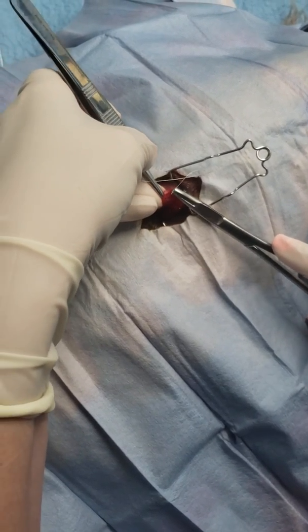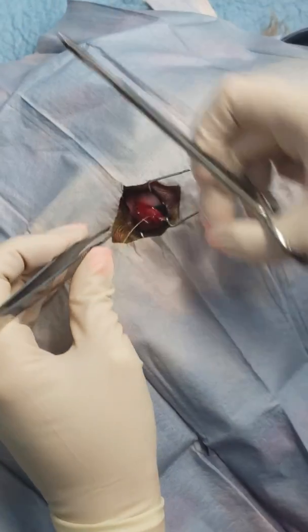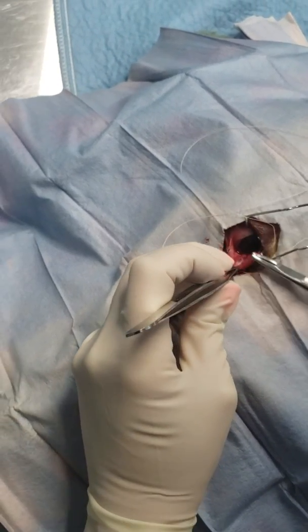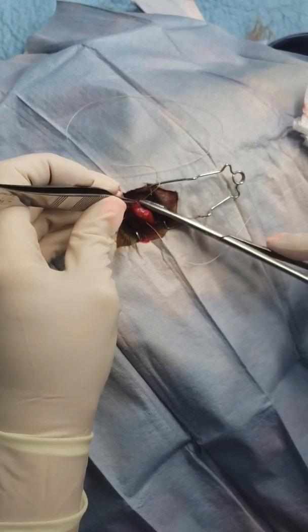You're going to start deep to superficial, and then on the other side we go superficial to deep.